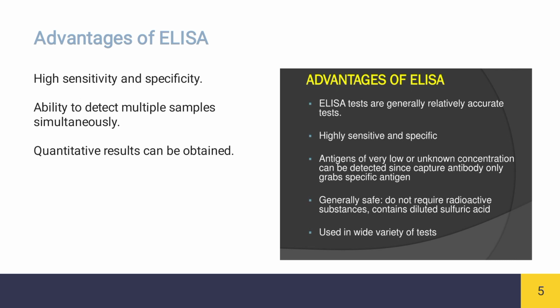They are used in a wide variety of tests. Antigens of very low or unknown concentration can be detected since the capture antibody only grabs the specific antigen. It is generally safe and does not require radioactive substances, and contains diluted sulfuric acid.